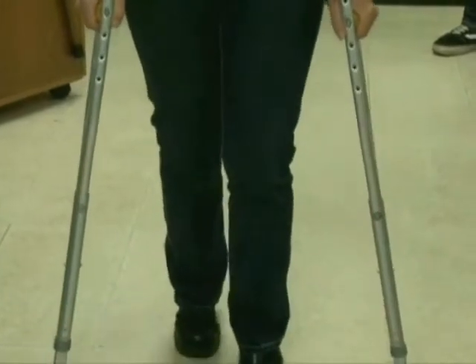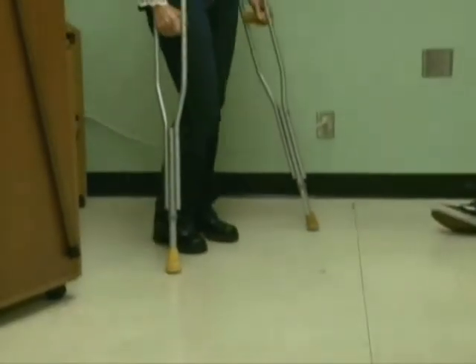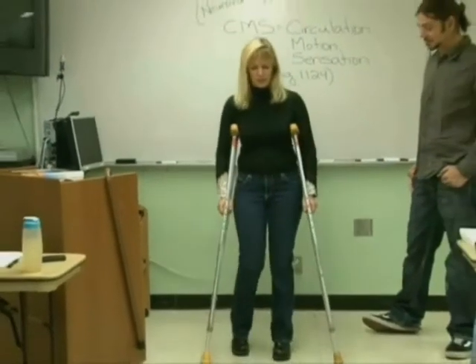As soon as I get crutches for you, I'll have you show me that you're doing that just fine. Once you're very experienced at that, you can start moving a little quicker on something called the swing-through gait.